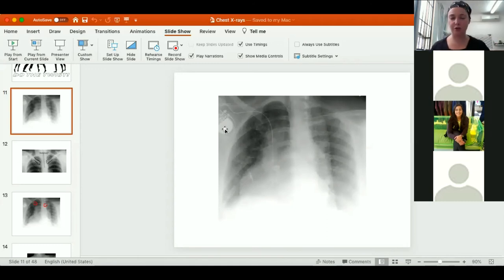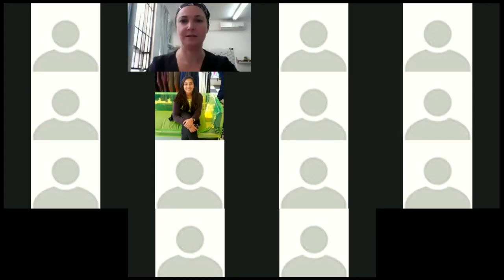You should have two. You'd find that the pacing one usually has a wire coming down off it that sits inside the right atrium. So you should see a wire coming out of it. Your pacing pads will tend to have wires going through to the machine. So you might see two wires, but it shouldn't end up going into the heart. So your pacemaker should look more like a computer. It should have a wire coming out of it that ends in the right atrium. Does that help? Okay. Yes, thank you so much. Pleasure.